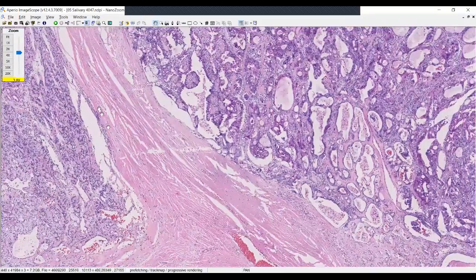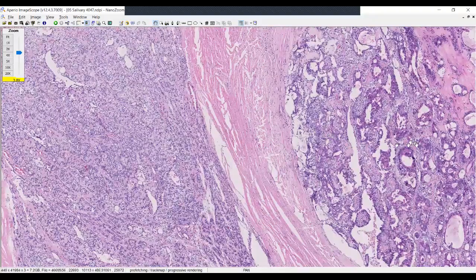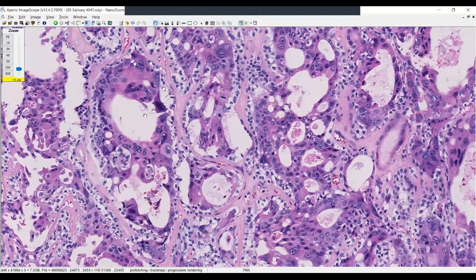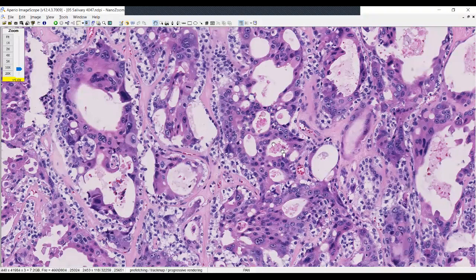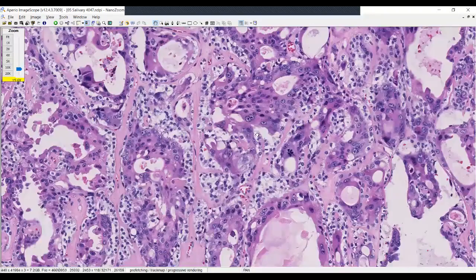However, as I go from that area, which is part of the nodule, into this, I think you can immediately see, if I just leave it at that space, that there is clearly a remarkable difference in what you're able to see in this side. And so as I go into this space, I think you can easily identify now that you're dealing with a malignant transformation. And in this case of carcinoma ex pleomorphic adenoma, this is an example of salivary duct carcinoma. And I think when you think about salivary duct carcinoma, it usually has some apocrine morphology present within it. And so as I look at this apocrine morphology, it really is a back-to-back cribriform architecture with a Roman bridge type appearance or punched out architecture.